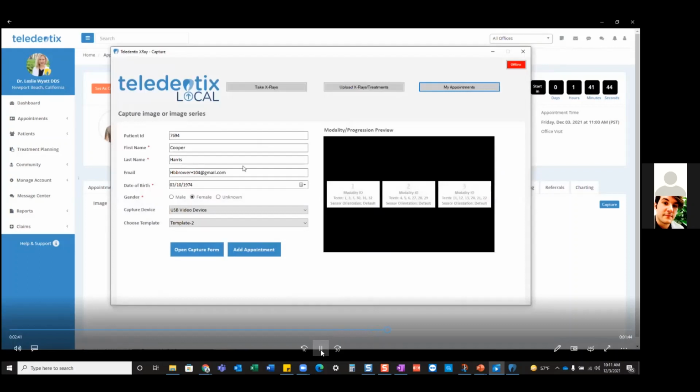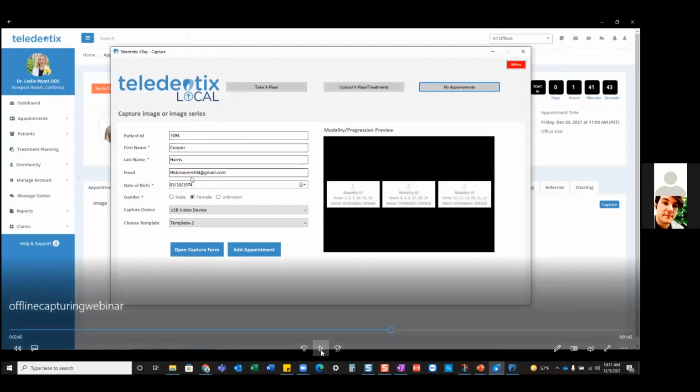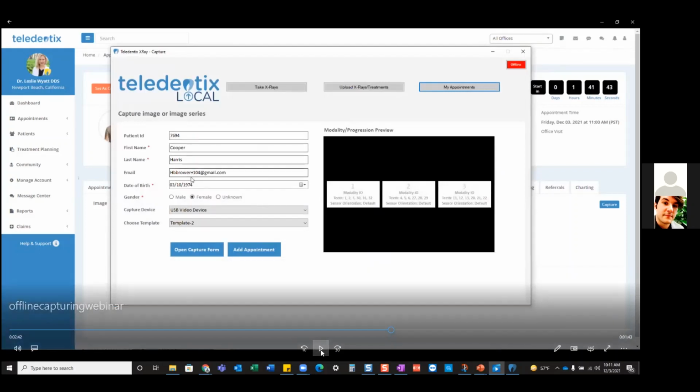I'm going to head on over to my next patient, Cooper Harris. Now, remember, this is completely offline. So all I did was I went into her line item and I clicked start capture.